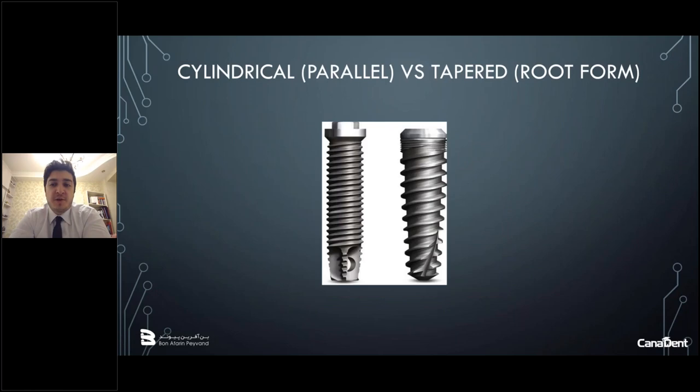The other design difference between the implants is parallel and tapered form. Parallel-sided screws were first documented extensively by Brånemark. In this type, we use graduated drills of increasing diameter, and it usually ends with a tapping or thread-forming instrument that creates threads that complement the threads of the implant.